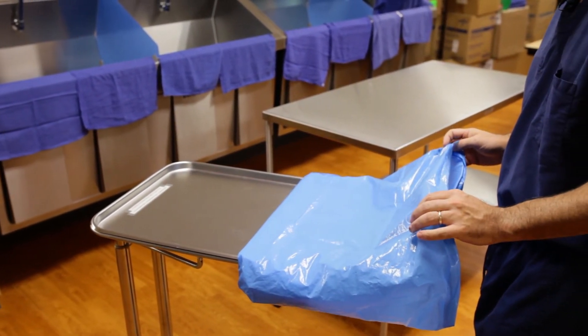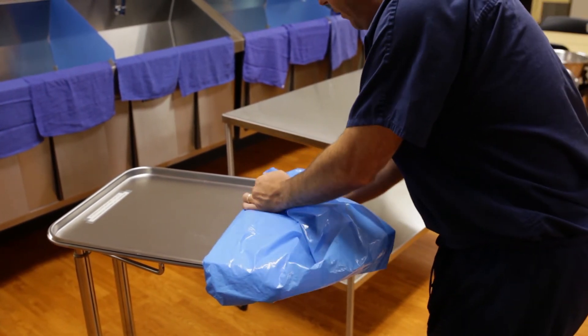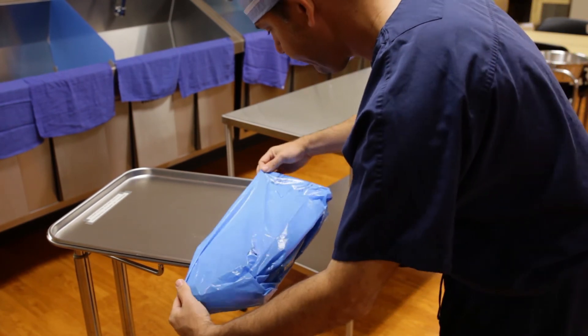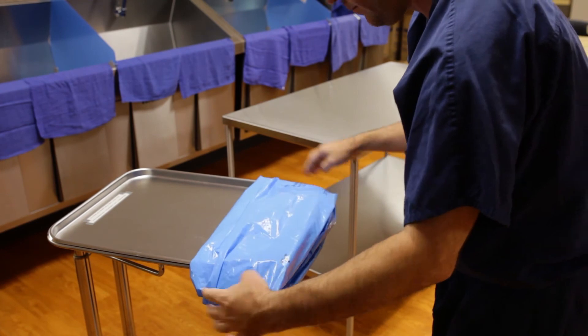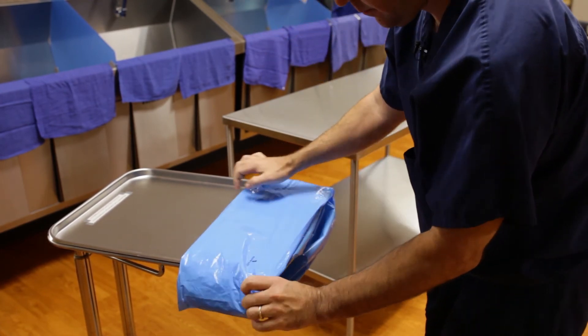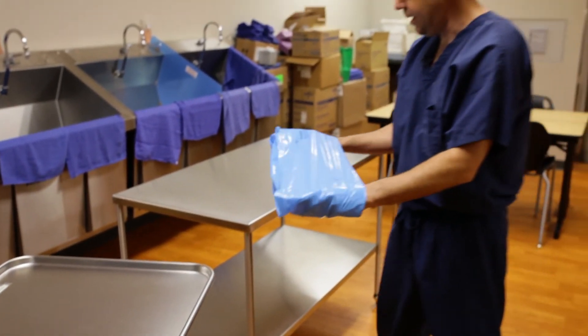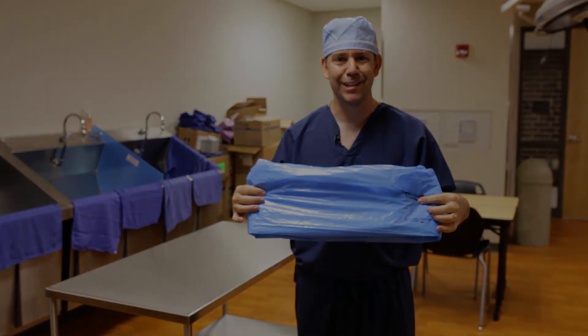The very last step is I'm going to turn it right side out and make this very last fold. And there we have a Mayo stand cover that's ready to go.